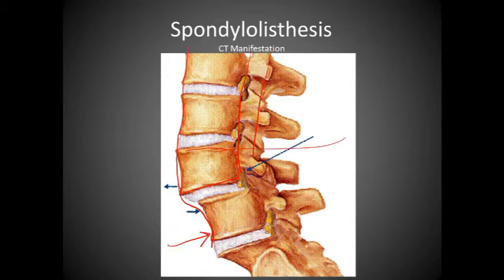It's questionable as to whether the superior vertebrae have actually shifted anterior, or L5 has actually gone posterior. I would favor that L5 has actually gone posterior, but we don't really know. The only thing that we can actually discern is that we have from this point to this point a shift, and so that's probably around 25%. It's no more than 30%. So this could be a type 1 or a type 2.